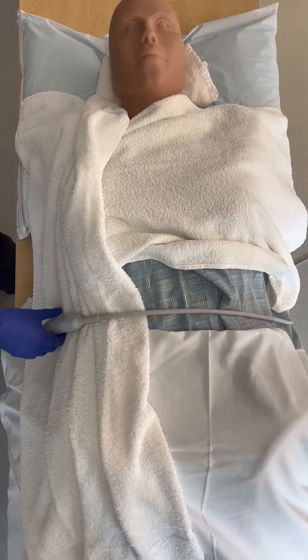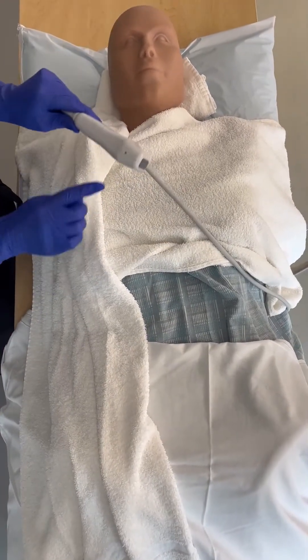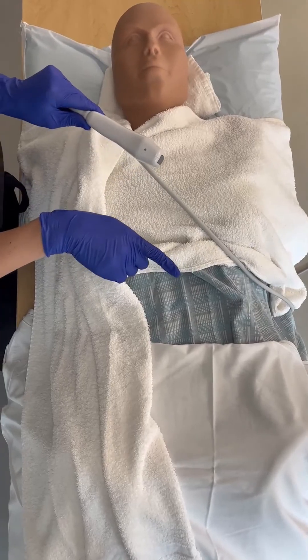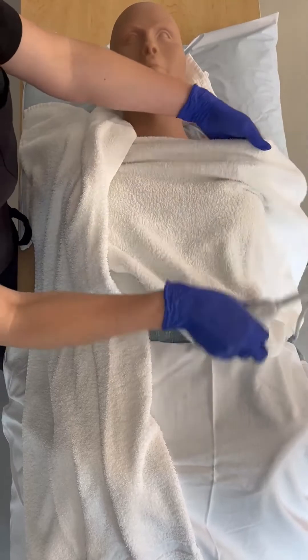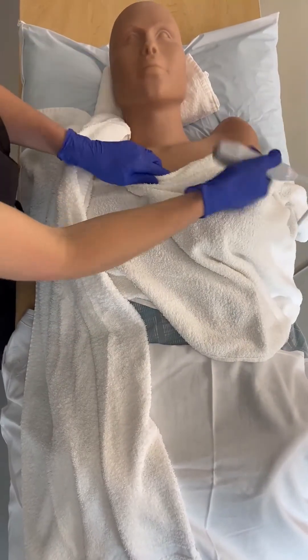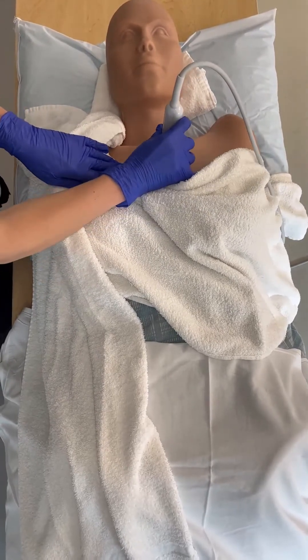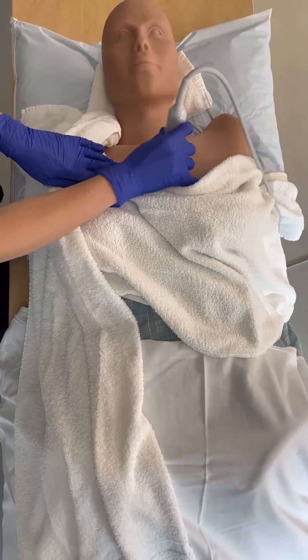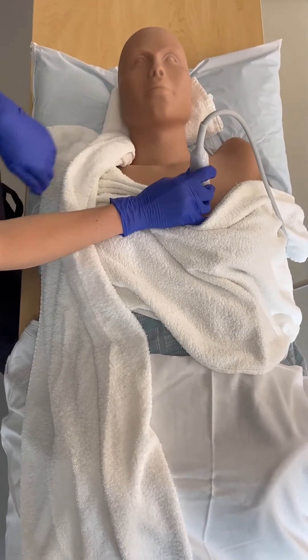The first view we're going to do is the parasternal long axis view. We'll use the cardiac probe with the probe marker pointing towards the patient's left hip. We'll leave the horizontal towel covering the patient's chest, lower the gown down, and place the probe to the left of the patient's sternum. From here we have access to the entire left side of the patient's chest to get our parasternal long axis view, and the patient is still covered.